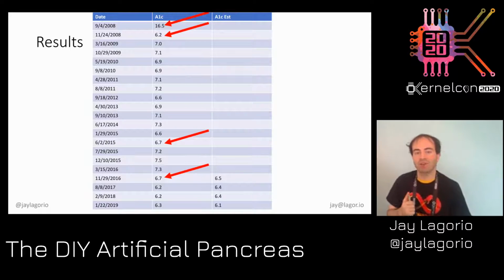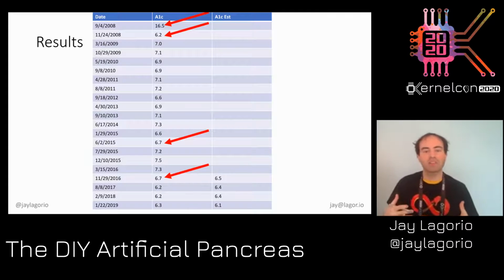And that fourth arrow that you see, that was after 6 months of using OpenAPS just at night. And I want to emphasize that I was able to have snacks before bed. I wasn't going to bed at that very high level. I let OpenAPS handle my meals. I just look at the numbers to make sure that they're generally tracking to what I want. The cognitive load and the effort to do things was so much lower.